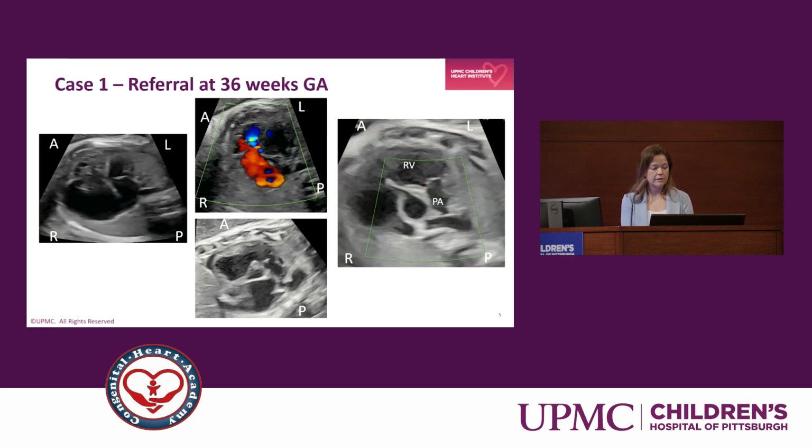In the clip on the left, we can see, again, this is the right atrium and right ventricle, and we can see fairly mild displacement of the septal leaflet, but significant abnormal attachments and dysplasia of the leaflets, creating an area of non-coaptation, again, severe cardiomegaly and right atrial enlargement, and the right ventricle in this baby was more on the dilated side and not hypoplastic.